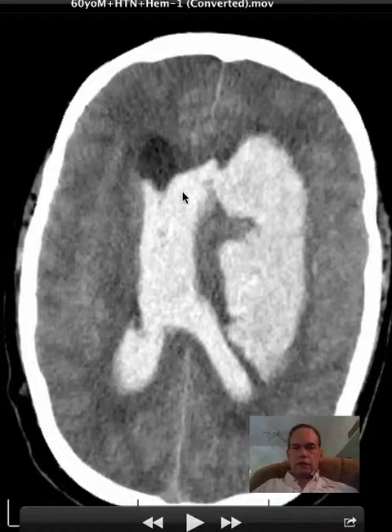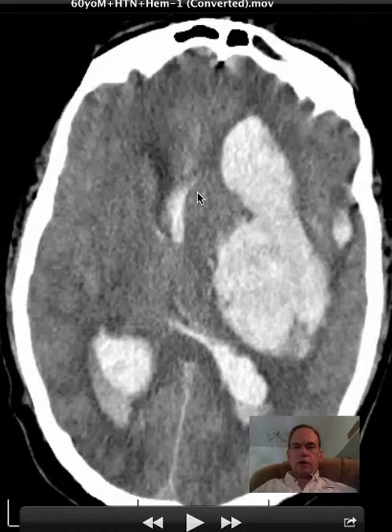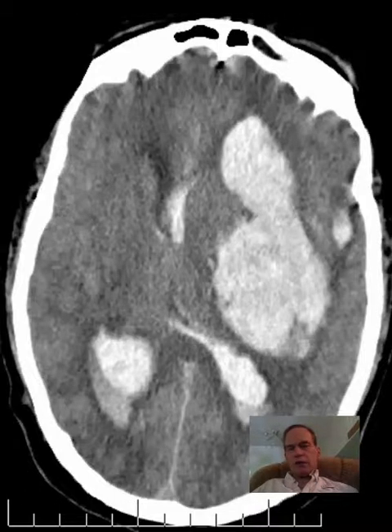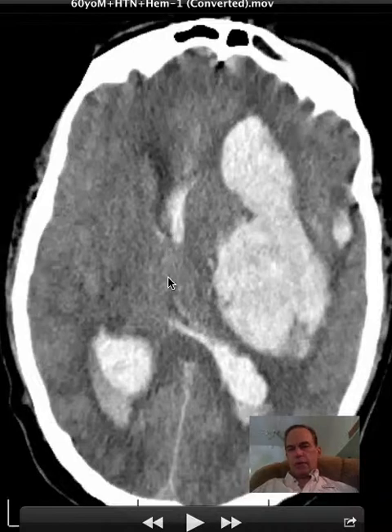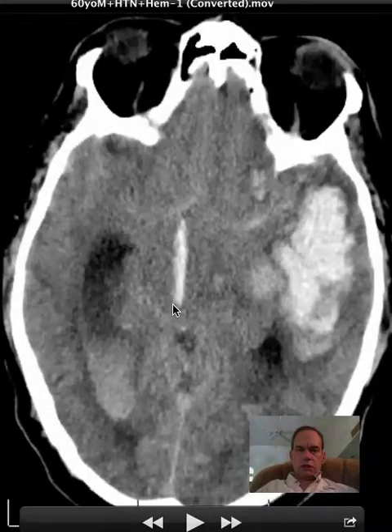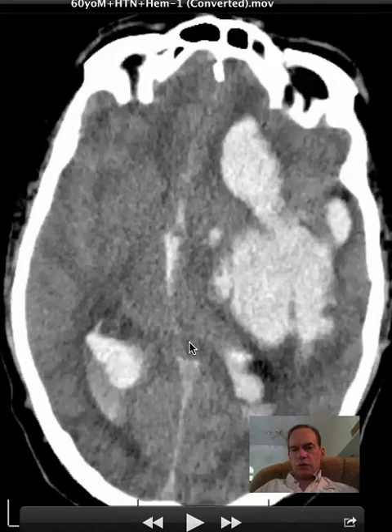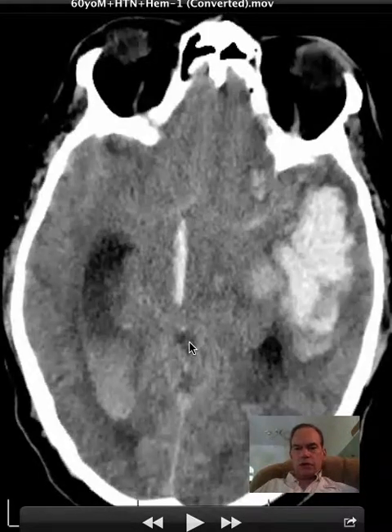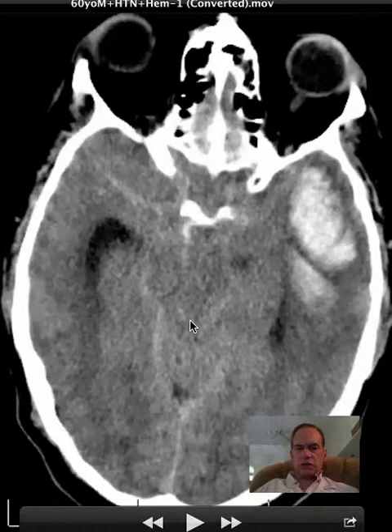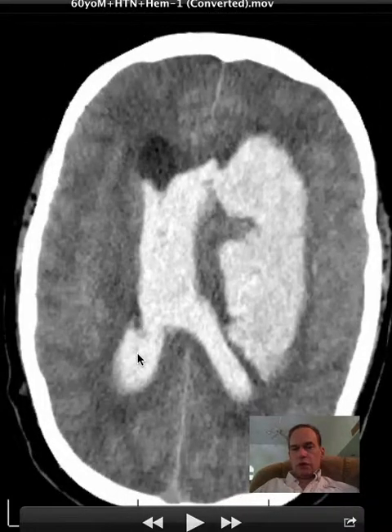The right and left lateral ventricles empty through the foramen of Monroe — there's one on each side — into the third ventricle. And then from the third ventricle, it has to go through the cerebral aqueduct to get to the fourth ventricle. The cerebral aqueduct is just slightly deep to the overlying superior and inferior colliculi. It's right in here and it's being squeezed, so there's not much getting through there. That is why the lateral ventricles are a little distended.